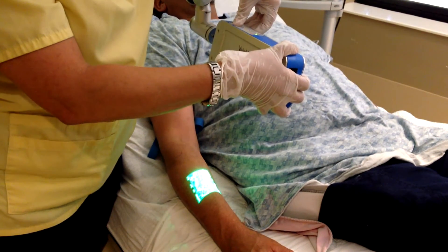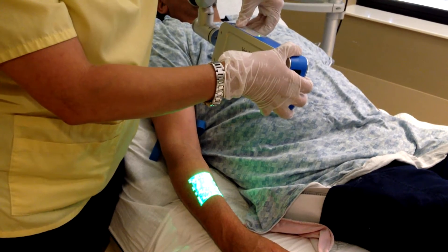It's a very vital tool and I'm going to demonstrate it now. We're down here in his right forearm and you can see a couple of good veins right here — one right there and one right here. I'm occluding it and then the blood flows back through it, so we know that that's a vein.